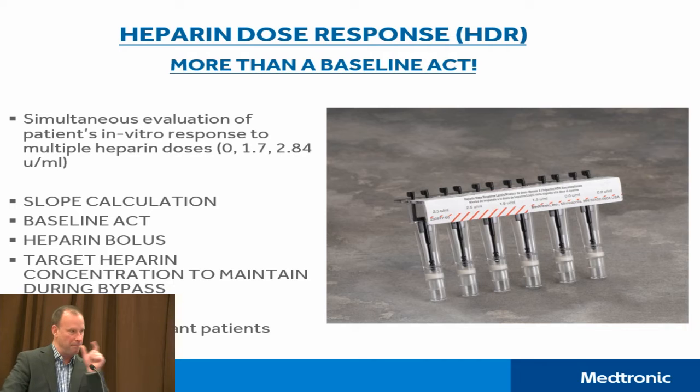And just kind of back up on this slope, so the part of the protocols that your point of care folks may ask you to do is to give them, some do 20, some do 50, slope values at the beginning of every calendar year. And what they do, they discover, of those 20 or 50 patients, whatever N they decide, your mean slope value and range for that calendar year.